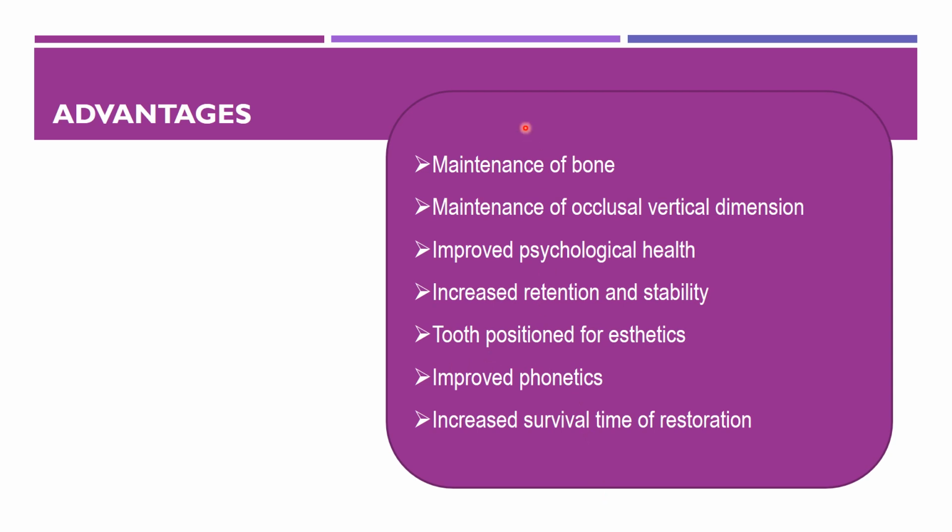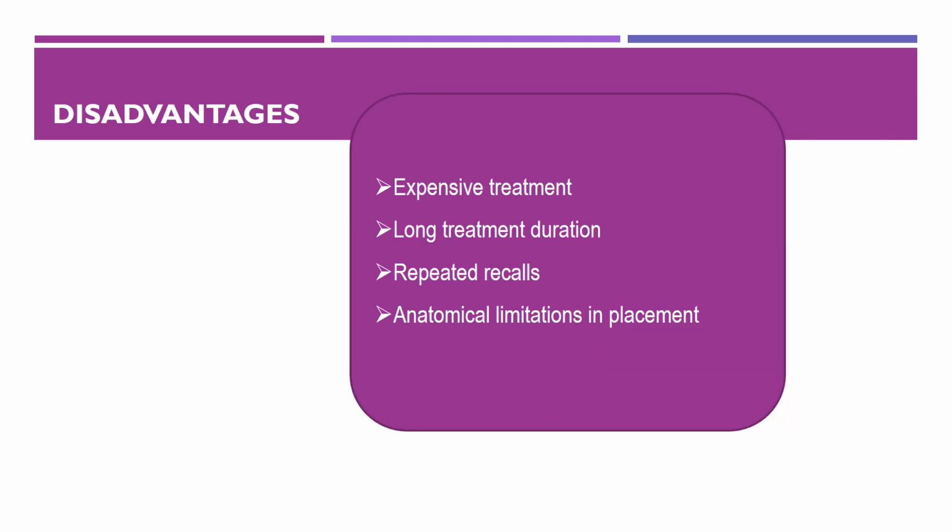What are the advantages? Obviously, there will be maintenance of bone, maintenance of occlusal vertical dimension, improved psychological health, increased retention and stability, tooth positioned for aesthetics, improved phonetics, increased survival time of restoration. Coming to the disadvantages, obviously it is expensive. Compared to the other treatments, it is very expensive and a long treatment duration is needed. And repeated recalls are always necessary for the longevity of implant success, and there are anatomical limitations in placement.